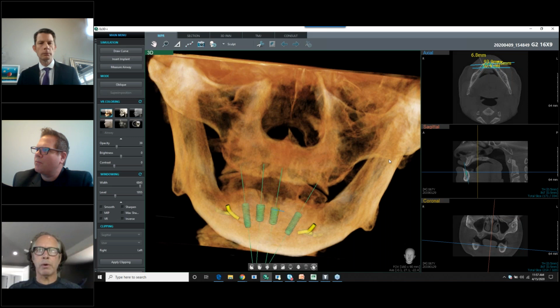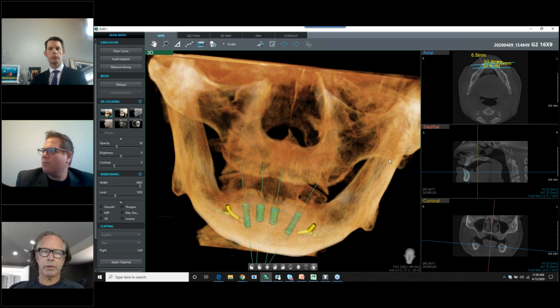And it allows you all of the colors, the coloring books, and you just gather this information and you paint this picture for them. And they leave going, wow, this makes a lot of sense. Now I just have to figure out what I can afford. Do I want to take this prosthesis in and out, et cetera? Well, now we shift to post-COVID, and things like this are more important than ever.